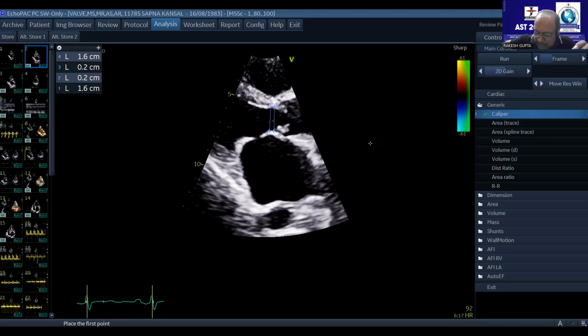That is the amount of blood which is flowing through LVOT with every beat. Now, this is the flow happening at LVOT. Now I have the aortic valve VTI, which is 66.91. If I divide this value by 66.91, I'll get the aortic valve area, and that is 0.80.